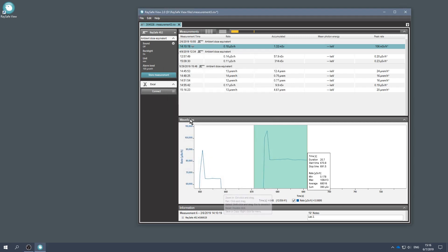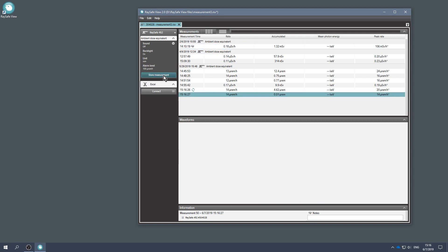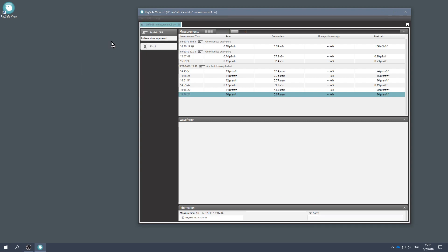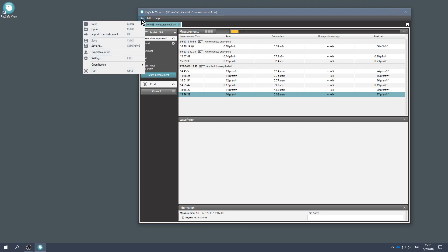You can also store measurements from RaySafe View. Click on the Store Measurements button. Save the RaySafe View file on your disk for later analysis or for documentation.